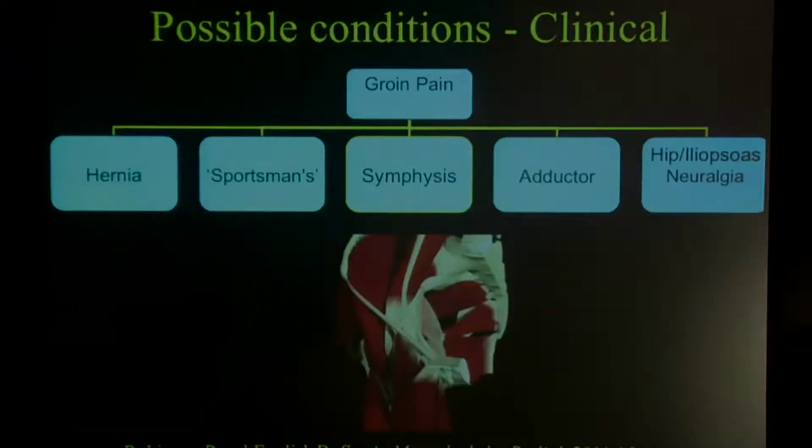So that's acute injuries. Let's move on to chronic injury. And if we look at groin pain, there are a number of causes. And again, it's already been largely discussed this morning. We've got hip iliopsoas, we've got hip tomorrow to discuss.